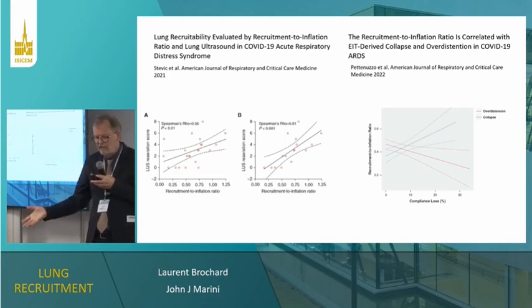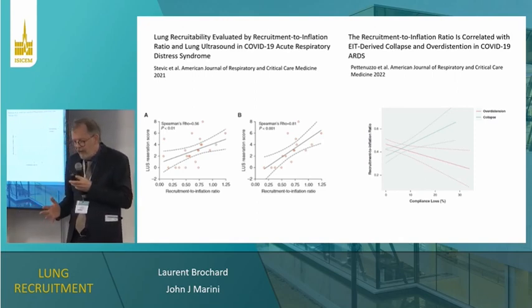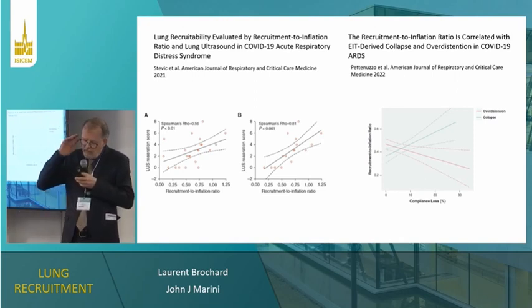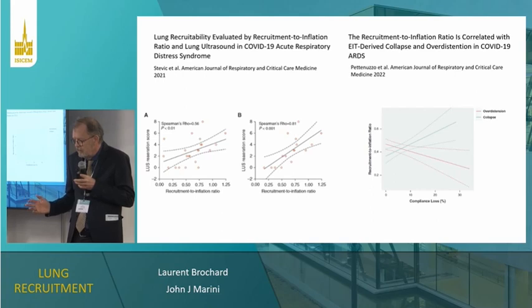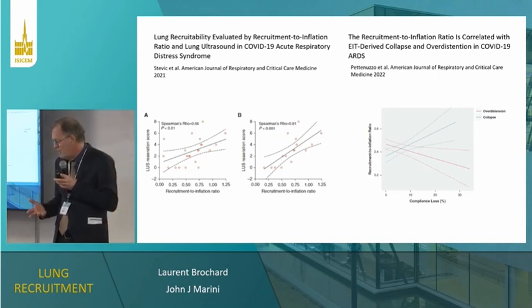And the next question, as you say, is how do you use it? In half of the patients, your R to I ratio will be 0.5 or lower. And then I say, stop, use the lowest PEEP possible, right? The lowest tolerable PEEP, which may be 8, 10 centimeters of water, but don't try to go higher because you will do more harm than benefit.